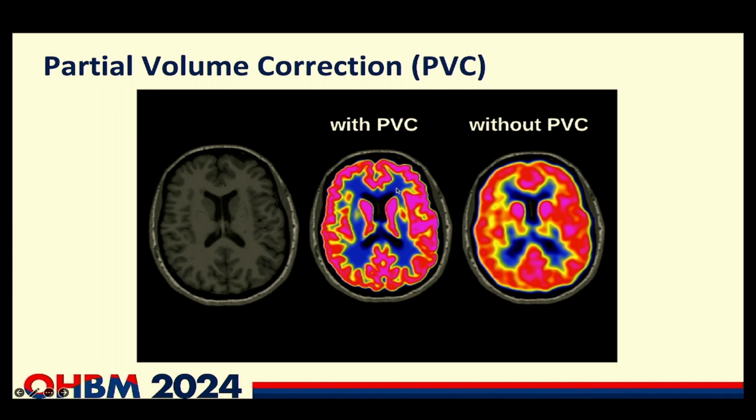And then maybe one final addition to that is that if you ask the FreeSurfer group, they would argue that you do partial volume correction like this, it gives you a better cortical representation, and then basically you project this data onto the surface, and then you do the smoothing along the surface. And that has been shown to have better bias-variance properties than doing it in the volume space.